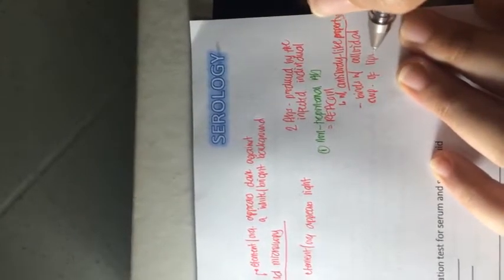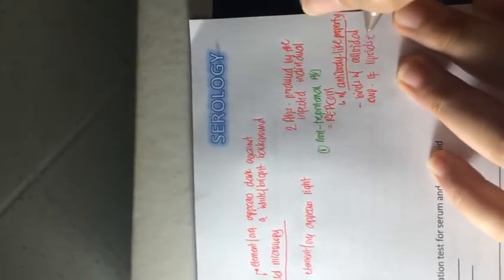It has an antibody-like property in a sense that it binds with a colloidal suspension of lipoids extracted from animal tissue.